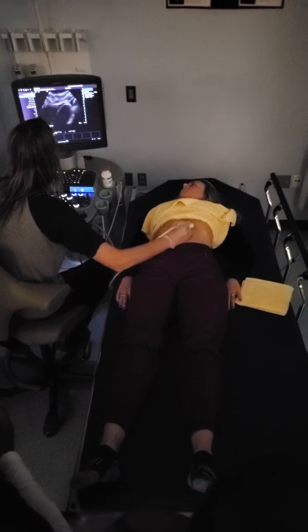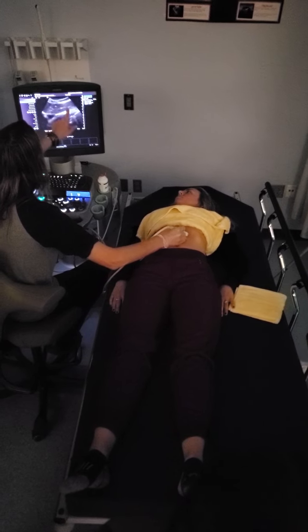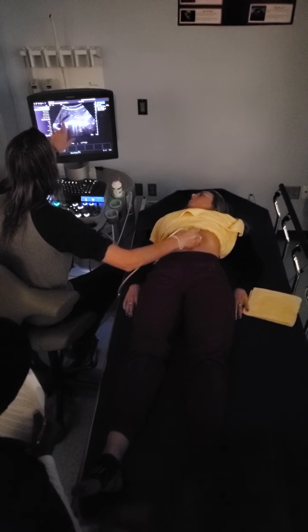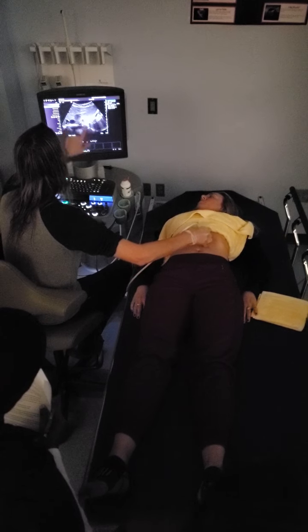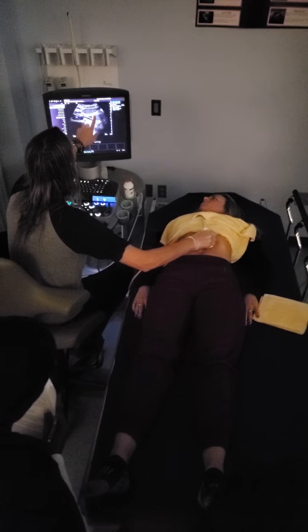So I'm all the way up, so we're at the area of the heart, so I'm all the way in the thorax. We're going to start to come down, and we're going to start to see, this is my lateral border. We're in the dome area, there's nothing really going on. As we creep down, we're going to start to see vessel land, so there's some hepatics going through. You might see some portals going through, and then we're going to scan all the way down, and eventually, you don't know this yet, but we're going to get to pancreas.